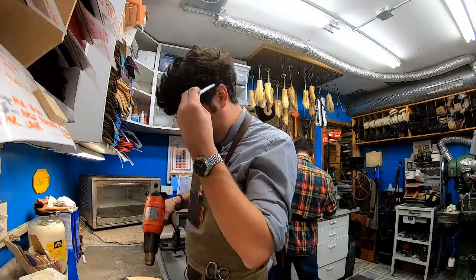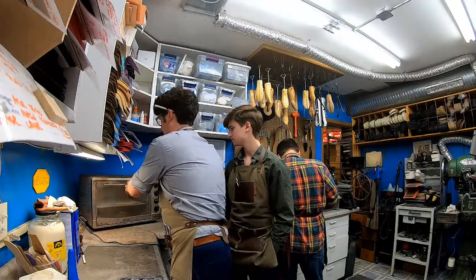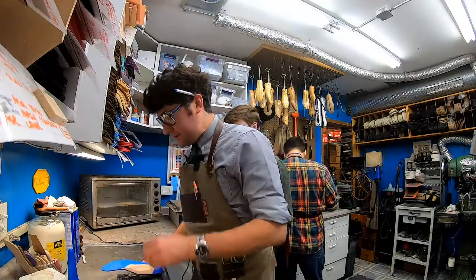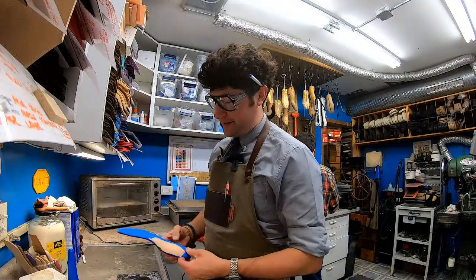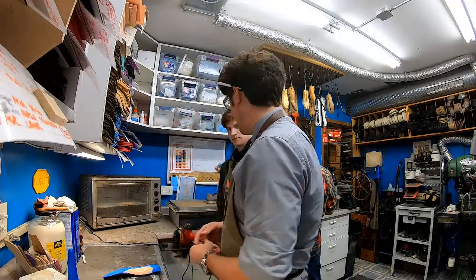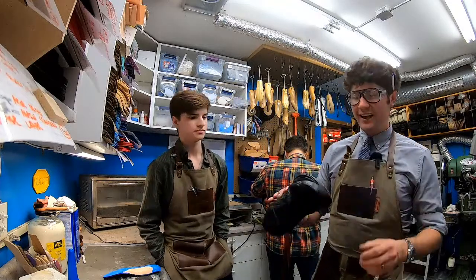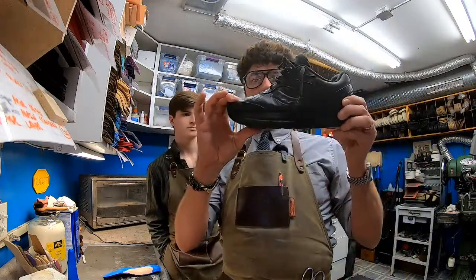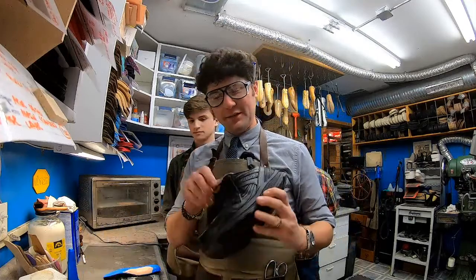Give the area a little heat in the oven. So we got a 3-step. I like to do 2 steps or less, but this is a little more complicated for an over-the-counter insert. The customer was worried about her shoes. She said, I might be walking kind of funny. Sometimes when you see this kind of blip up in the toe, the shoe might be too long. We measured her out, and that all seemed fine.